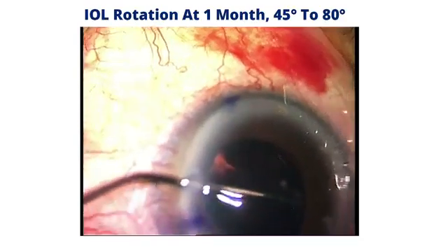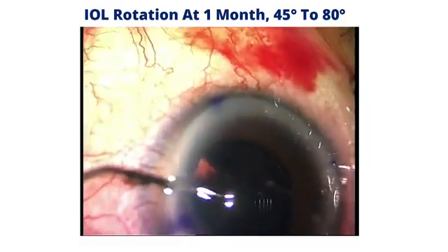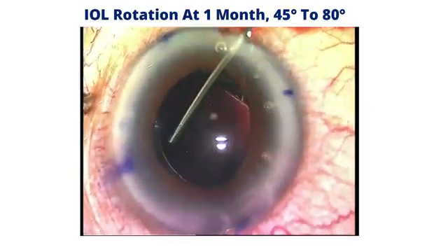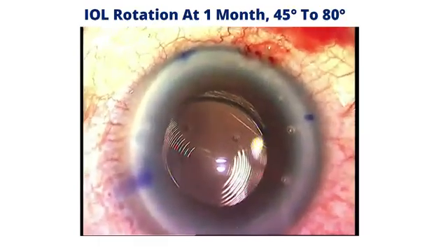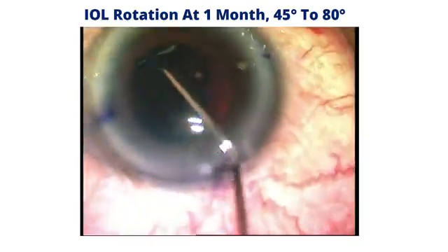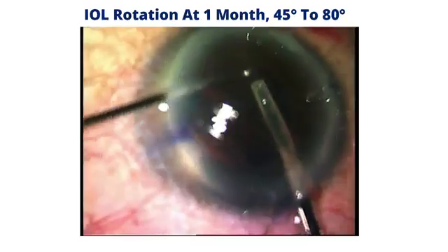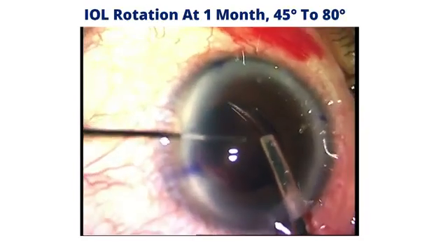So we start again with dispersive viscoelastic, and then I'm trying to nudge this lens, and you can see the striae more obviously here. Inferior nasally, I'm sitting temporally, and I'm just nudging the edge of that IOL. This happens to be a plate haptic lens in a very high myope, and I'm injecting viscoelastic to open up the capsular bag, and I'm doing the same for the opposite side, so that I'm trying to release the lens as well as inflate the bag.